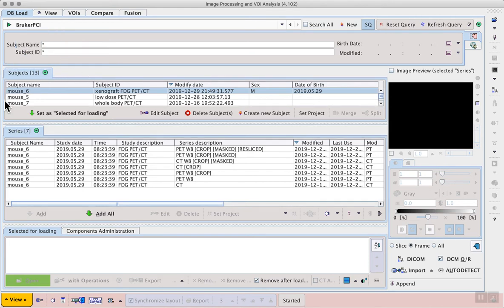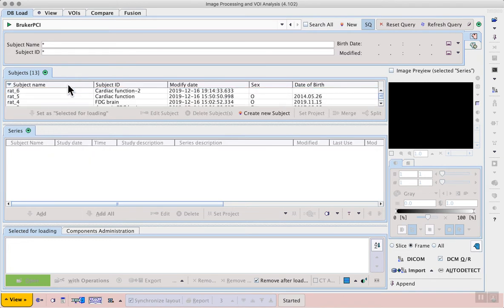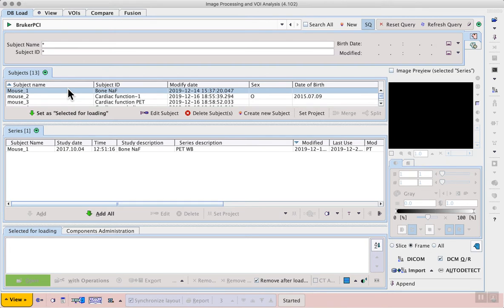We then see a tab for the subjects available where we can sort, for example by clicking on subject name and for a given subject we can see the series available and those series can be selected for loading.